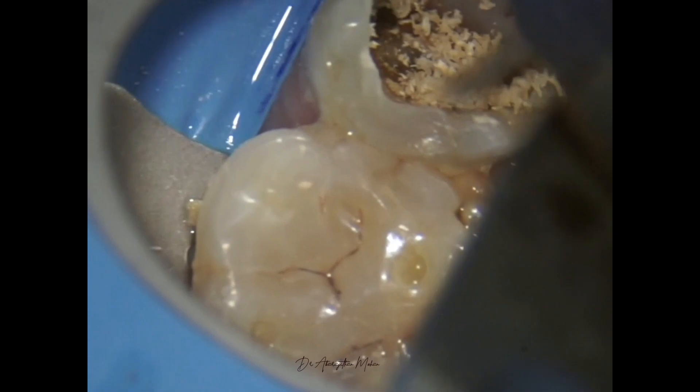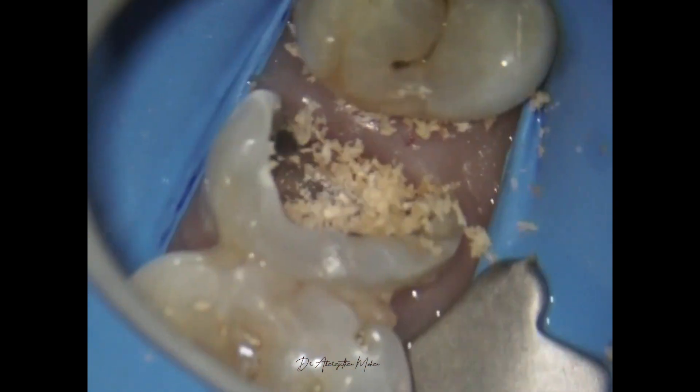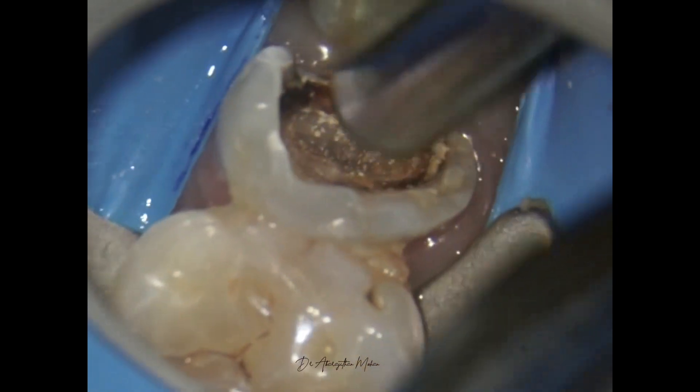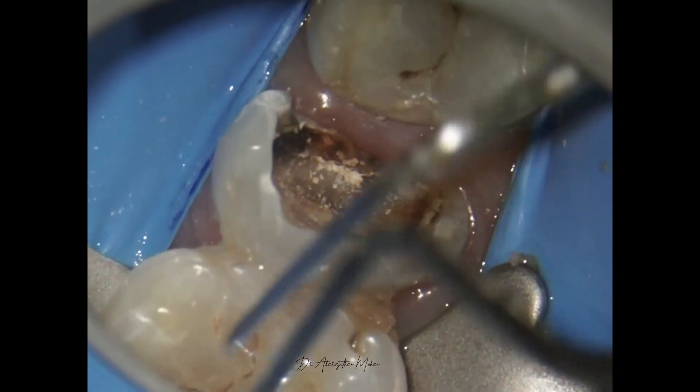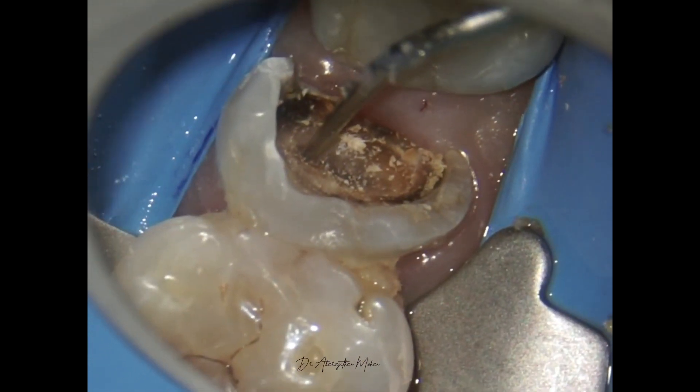These burs are made of tungsten carbide, so they are very active — I recommend using some magnification and not to use these burs blindly. However, they go a long way in locating these calcified orifices.